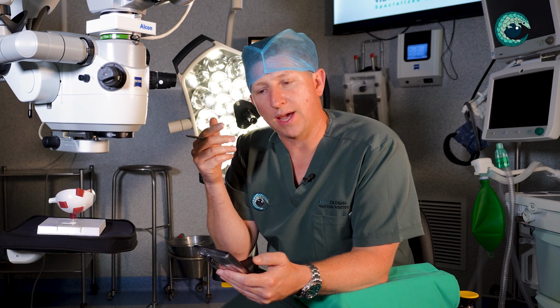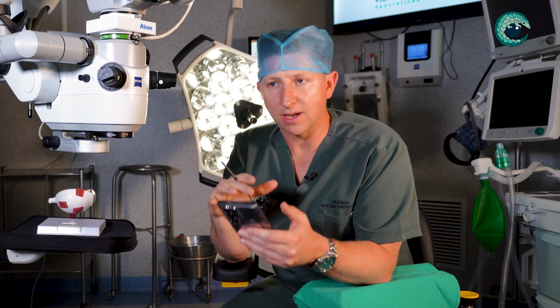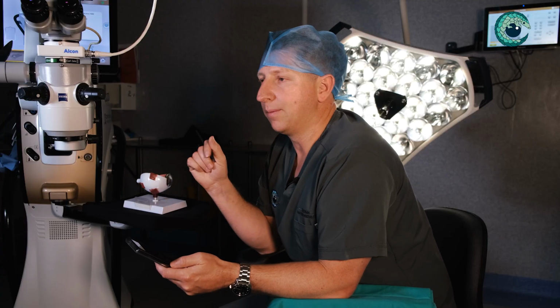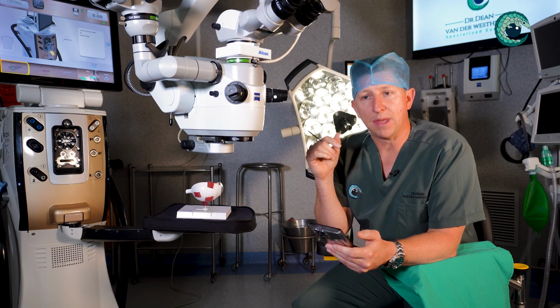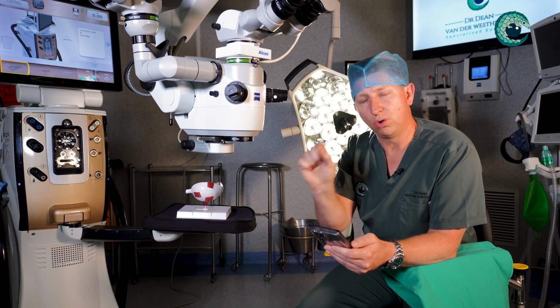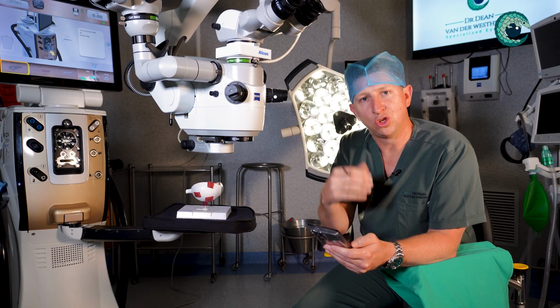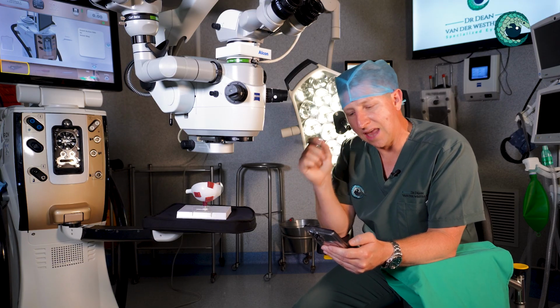If you took a vacuum and put it onto a closed ball like a soccer ball or a beach ball and you sucked, what would happen is obviously the whole thing would collapse. So we have irrigation that fills the eye to keep it under control. But what's really important in vitrectomy surgery is if you pull on vitreous, it can potentially cause tears in the retina. So as you suck, you have to cut to prevent causing traction. So this instrument sucks and it cuts.